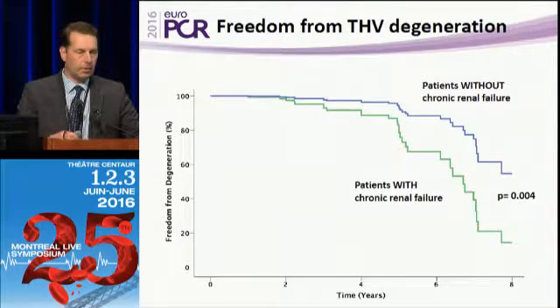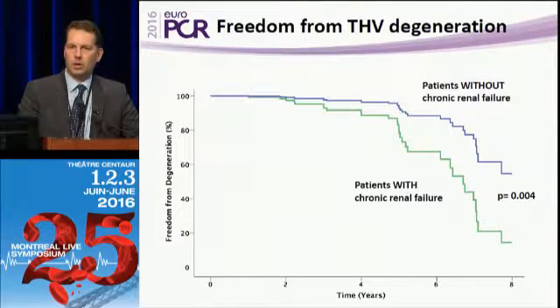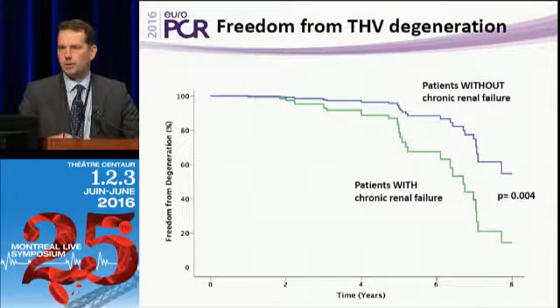And I think if anybody was going to throw a bit of a bomb or a cold shower on the TAVI party, this was what came out then. We need to know what this all means, because we don't know yet. But the implication for moderate risk and lower risk patients is quite significant. And here you see significant structural valve deterioration occurring in some patients as early as 4 or 5 years. So what does this mean?